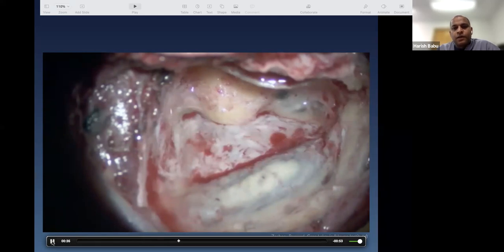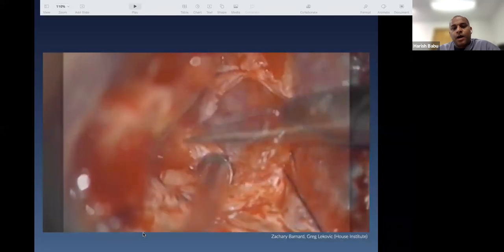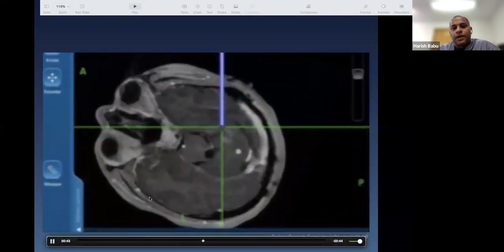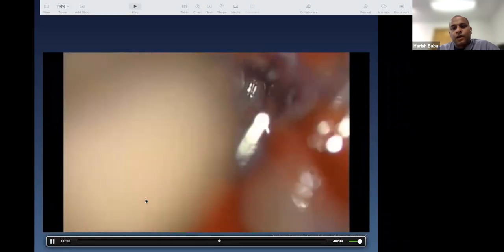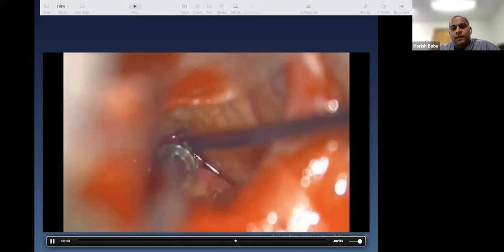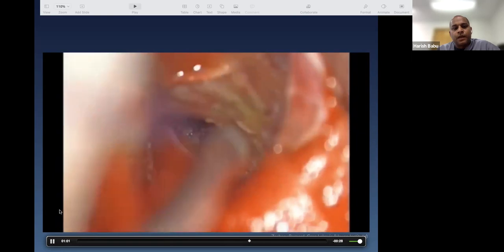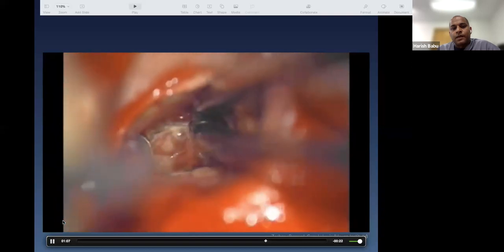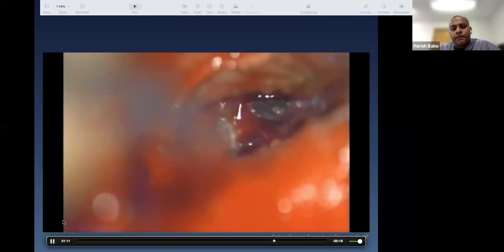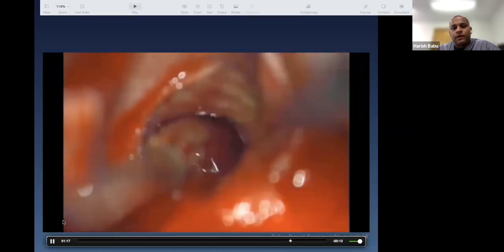The dura is opened and you enter the cerebellopontine angle. Intraoperative navigation confirms the exact target location. A small corticotomy is made — cavernous malformations typically have hemosiderin staining on top of them, giving them the classic mulberry appearance. Under the microscope, microdissection allows the malformation to come out in one piece, with surrounding hemorrhage cleaned up for a clean resection.